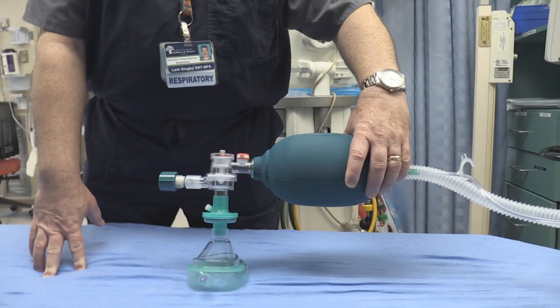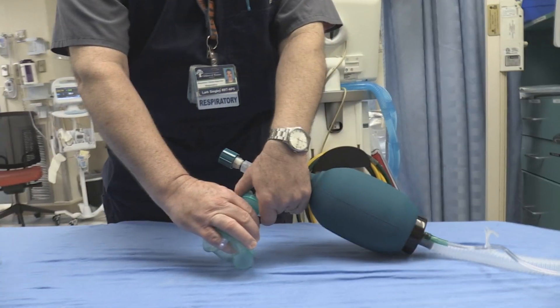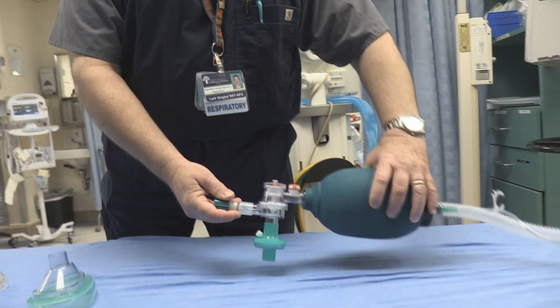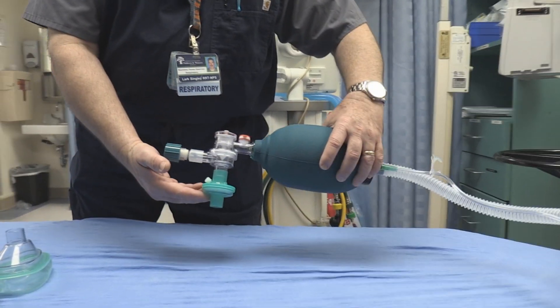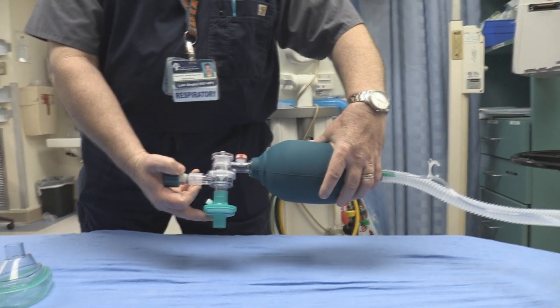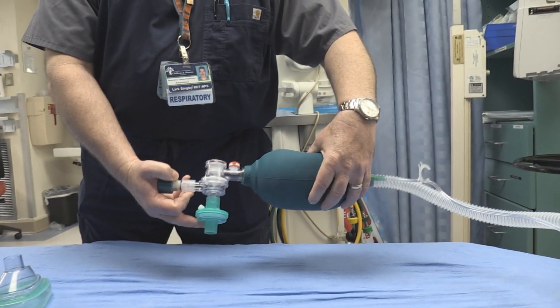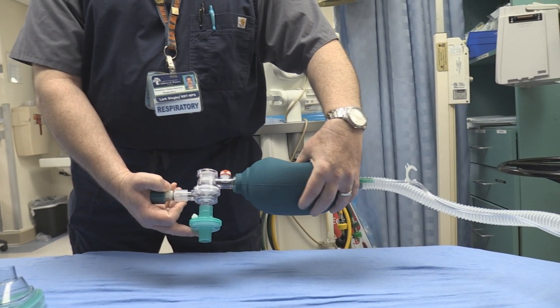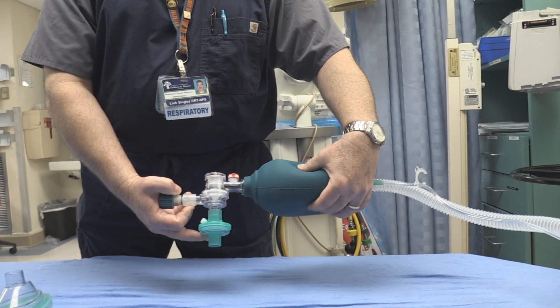So once you've got the patient intubated and you want to continue bagging, you would remove your bag and resuscitation mask, hook your filter directly to the ET tube, and then continue bagging manually. Everybody should be dressed out in PPE, and you want to limit the amount of time that you have the patient's ET tube open to the surrounding air.